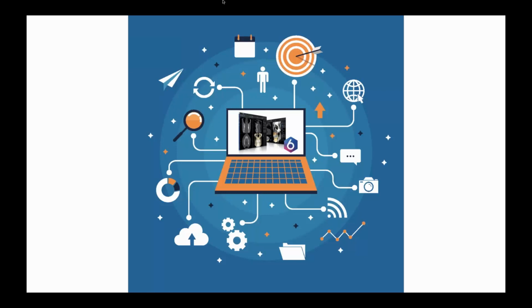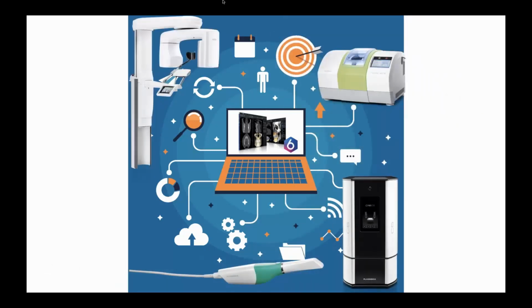The technology, the hardware that we use is incredible from Planmeca, but the software is obviously what ties everything together. The software at this point in the digital dentistry world is the critical component, and I think that's the magic behind what Planmeca has accomplished at this point.